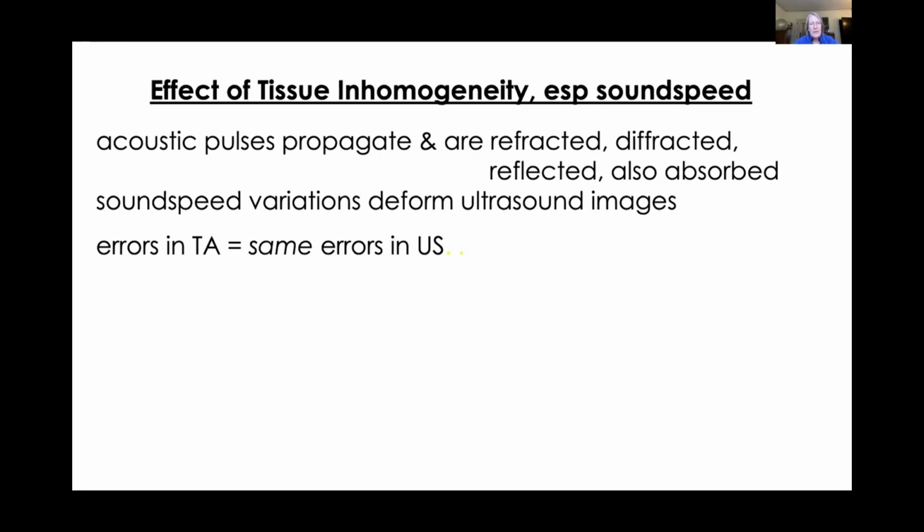But what we do know is that they deform ultrasound images. So, yesterday, let me take a step back. Yesterday, Liliana Borsia presented a very nice method of inverting without knowing your operator, without knowing the wave speed exactly. Here, my approach is much simpler. I'm just simply saying that if we can get a decent, diagnostic quality ultrasound image, it is subject to deformation due to sound speed inhomogeneity. That's the way ultrasound works.